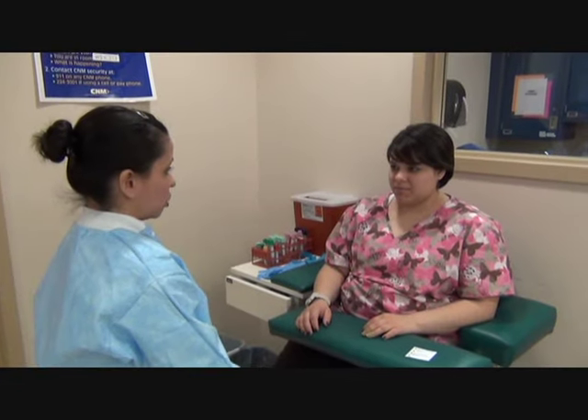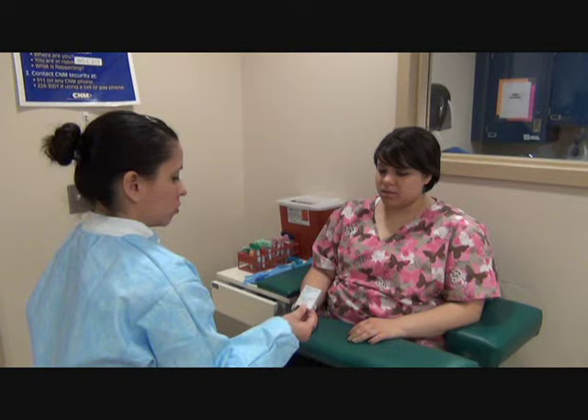Student, do I have permission to try your blood? Yes. Can you please state your name and date of birth? It's Charlson Garcia, 9-24-91. I'm going to go wash my hands and glove up. I'll be right back.